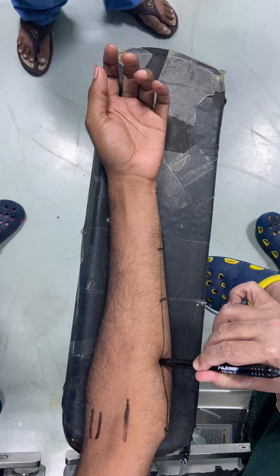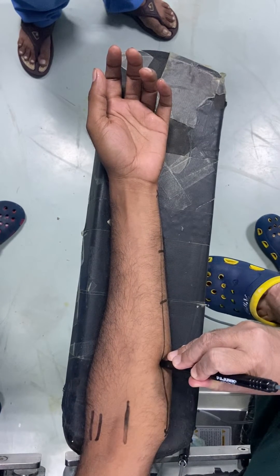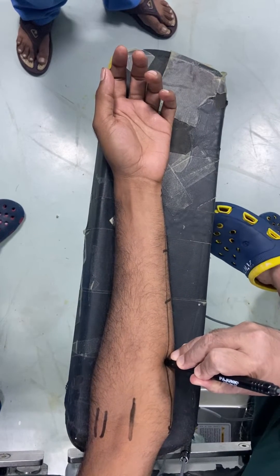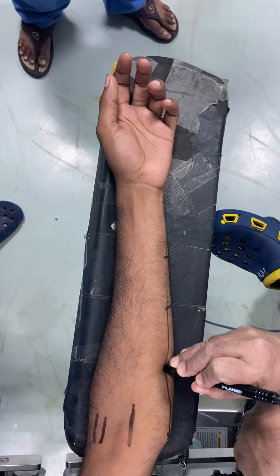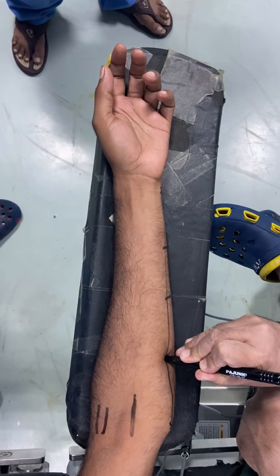Here you can see I put the needle and I will look for the response. I'll increase the current a bit, and here you can see the flexion of the fingers — the little finger and ring finger are flexing. This is how you can give an ulnar nerve block with PNS.